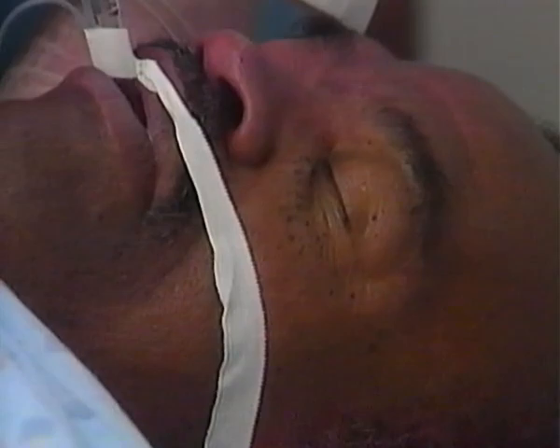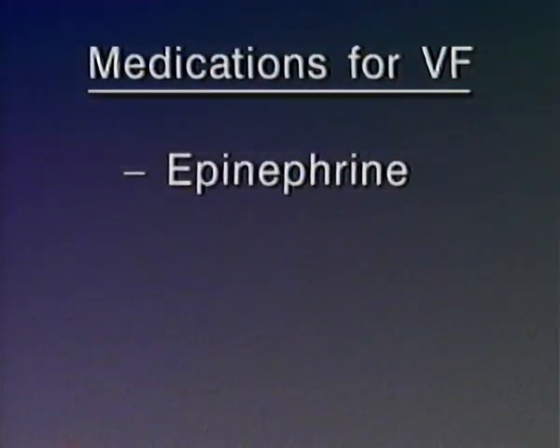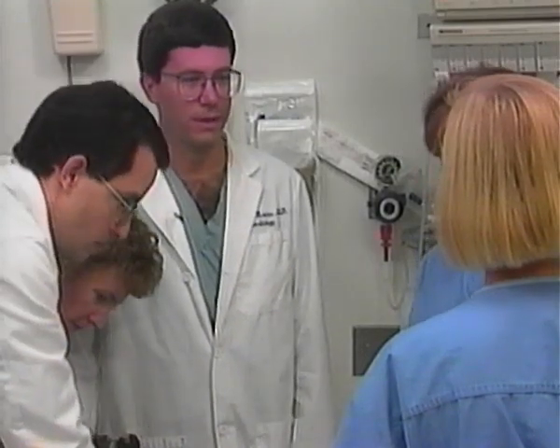What's the patient's history? Came in last night with chest pain. He has a permanent pacer, but no other cardiac history. He's currently on IV nitro and IV heparin. Since epinephrine with defibrillation has failed to convert the patient's VF, the clinician moves on to other antiarrhythmic medications. The first of these is lidocaine. The patient's history and current medications do not provide any contraindications for lidocaine. He's still in VFib. Let's go ahead and give him 1.5 milligrams per kilo of lidocaine.